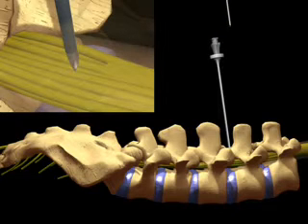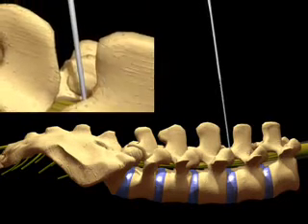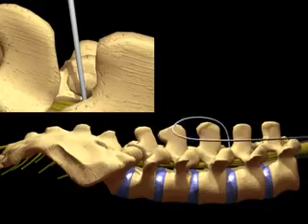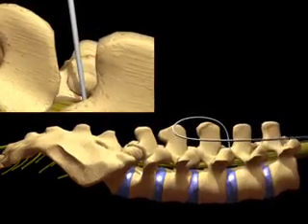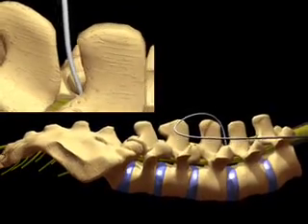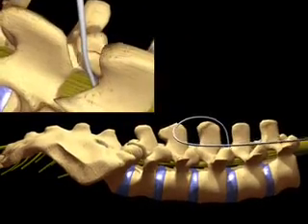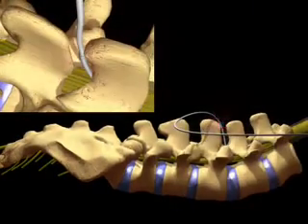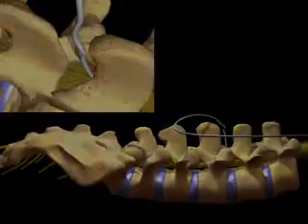The sharp bend in a catheter can also make withdrawal of the guide wire difficult in a catheter that is placed using a midline needle technique. Even if the catheter is successfully inserted and the guide wire withdrawn, catheter placement between the lumbar spinous processes or ligaments can lead to catheter failure. Over time, the spinous processes and ligaments may compress or abrade the catheter due to friction or pressure. This creates another potential cause for catheter fractures and breaks at the level of the lumbodorsal fascia.